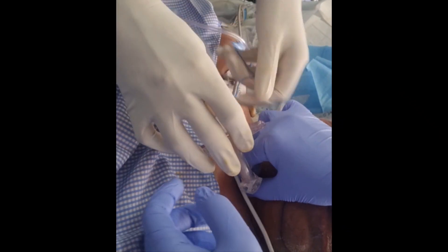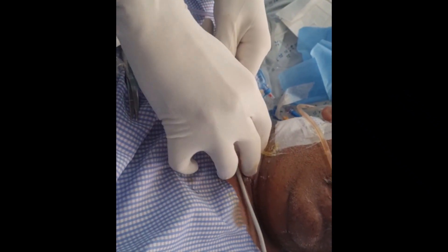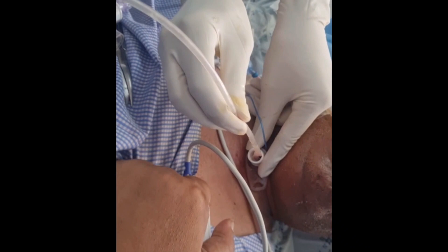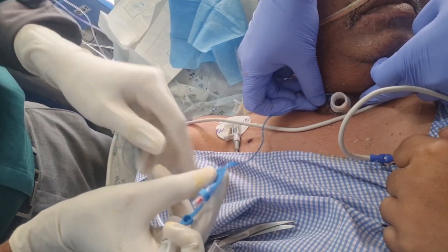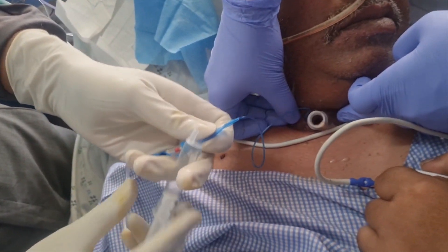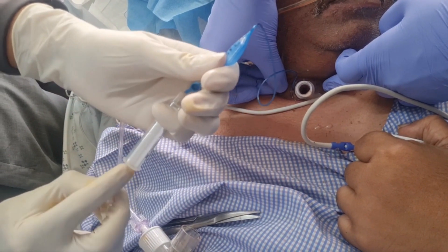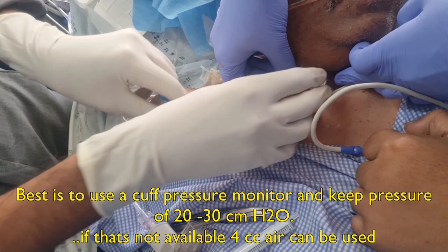We are sure the suction canula is inside and we insert the new tube — it goes inside. We remove the suction canula as the tube advances. The assistant holds the flange so it does not come out. We initially inject 8 ml of air into the cuff, which we will reduce to 4 ml once the patient is settled.